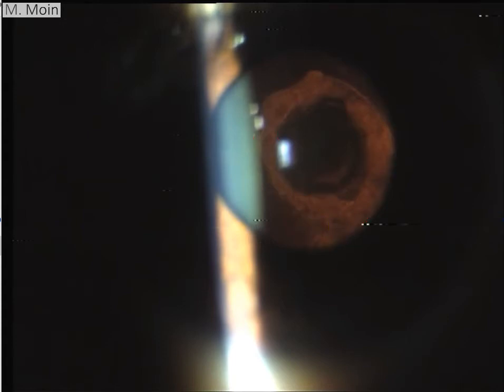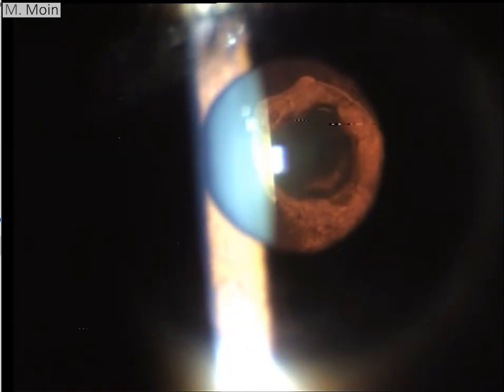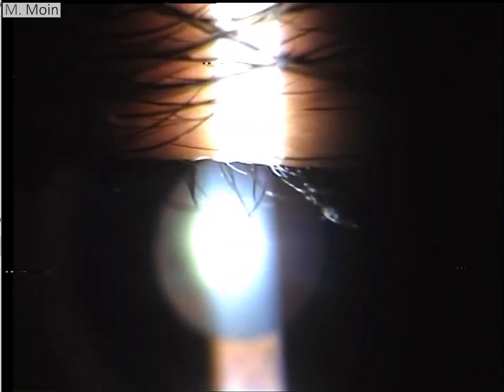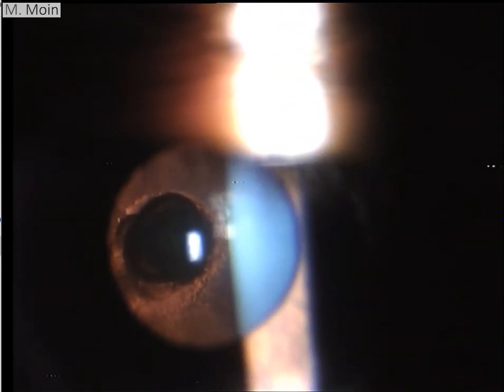So let's go forward on this and the pupil was slightly mid dilated for examination. You go and see on the other side as well and yes it was a familial autosomal dominant type and here you can.